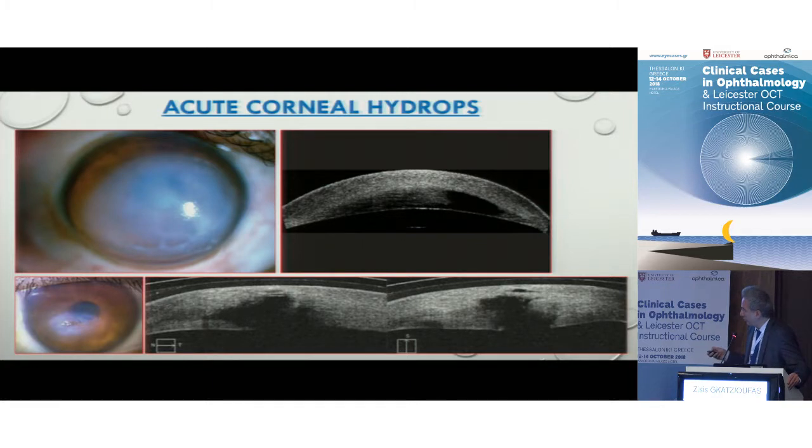We can observe the course of the disease and the regression of the fluid in the corneal stroma and take the best decision for our patients.